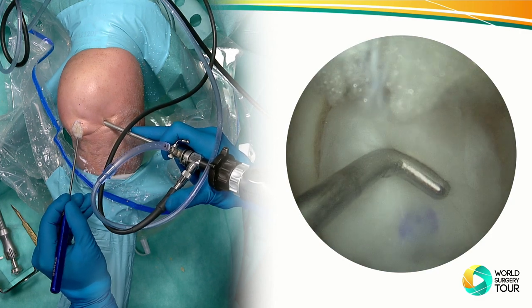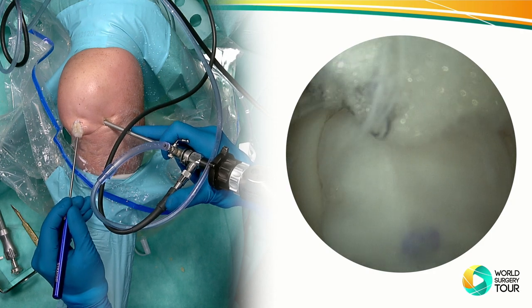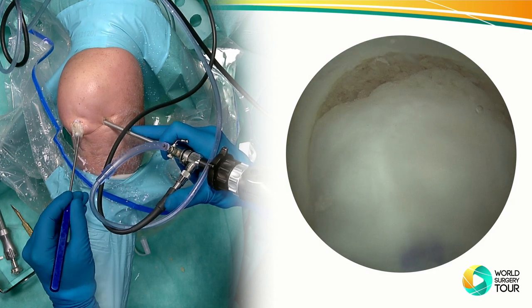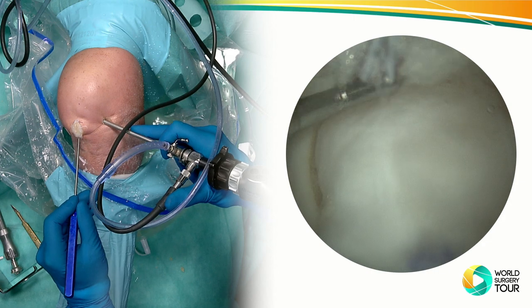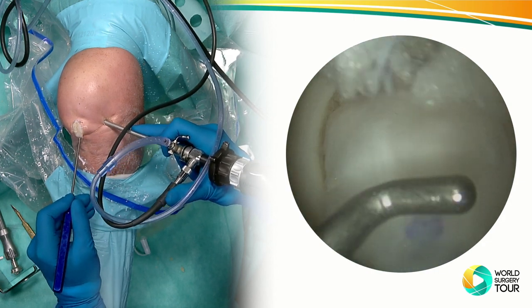To be quick. And you see the pieces here. And again, if you're worried that maybe there's a very small rim left, the membrane expands, cells grow out, so they will eventually cover obviously the whole defect.